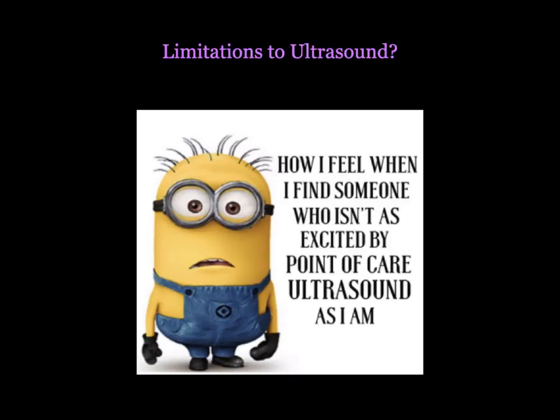Other limitations to ultrasound include the fact that it is operator dependent. This is something that we had talked about a while back. The more ultrasounds you do, the better you get. So I would encourage you all to start scanning as soon as you can to improve not only your agility with ultrasound, but also your ability to make the correct diagnosis. Obesity. Obesity is known to decrease or degrade ultrasound images and can make it harder for you to figure out what's going on. And I'd say finally, really be thoughtful about pain.